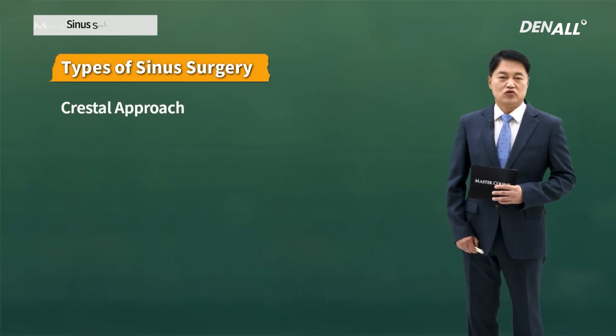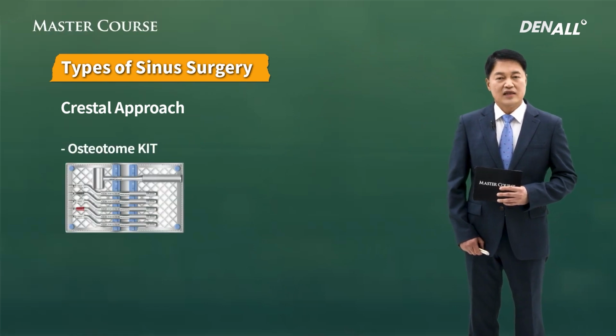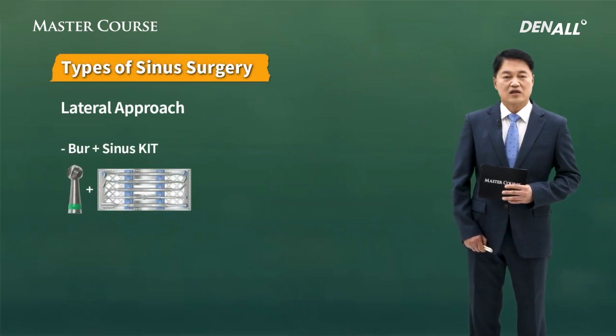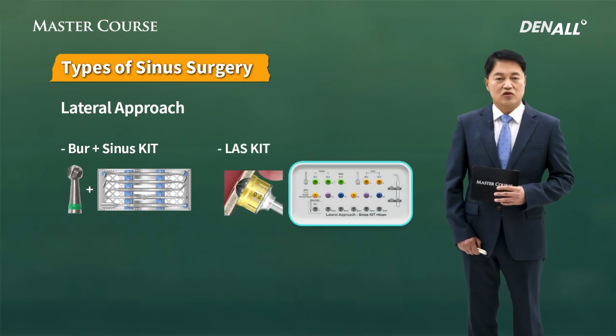Let's look at the instruments used for crestal approach. Osteotome kit or CAS kit can be used. In lateral approach, you can use burr or plus sinus kit or LAS kit.